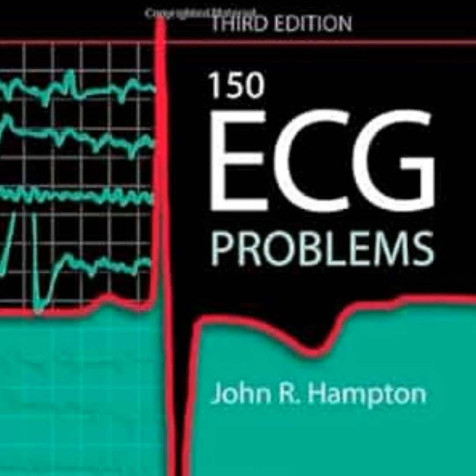Right? Very clear. The ECG is an essential tool, but it is totally subservient to the history and the physical. Normal variants must be deeply understood so you avoid overdiagnosis. Systemic causes like electrolytes and toxins have to be considered when the electrical system misbehaves. And above all, you must respect the anatomical fragility of these conduction pathways. Well summarized. Thank you.